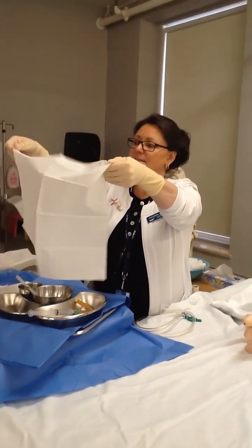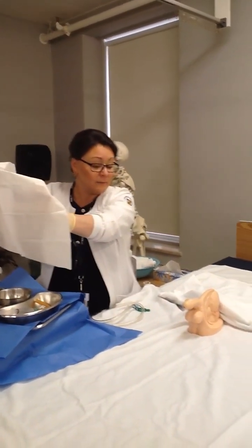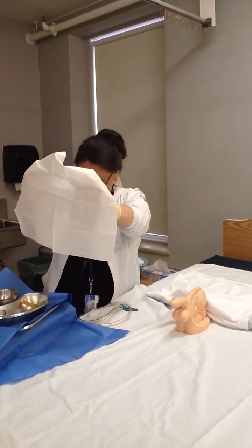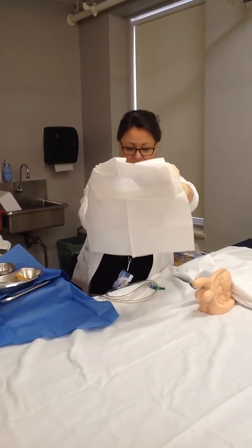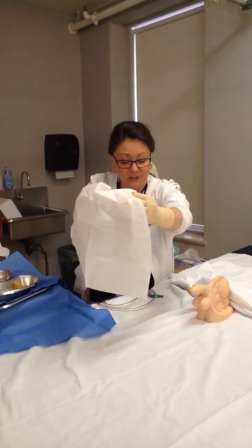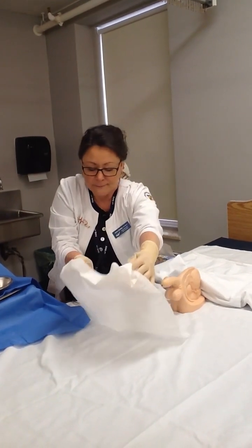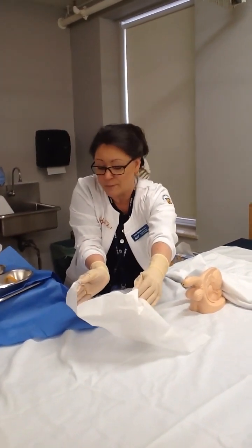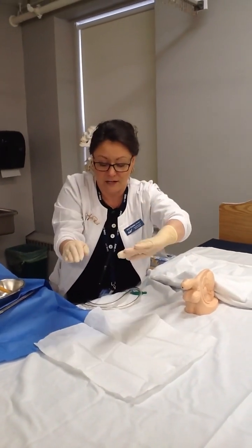I'm reaching my hands underneath and I'm protecting my sterile gloves. I'm coming in front of the genitalia, and you can use your foot to push the tray out of the way if it feels like it's in your way and you want to move it. I'm coming in front of the genitalia a fair bit with this paper drape, and I'm just flicking it out. There would normally be thighs on each side of me, and I'm making sure my sterile gloves aren't touching that.